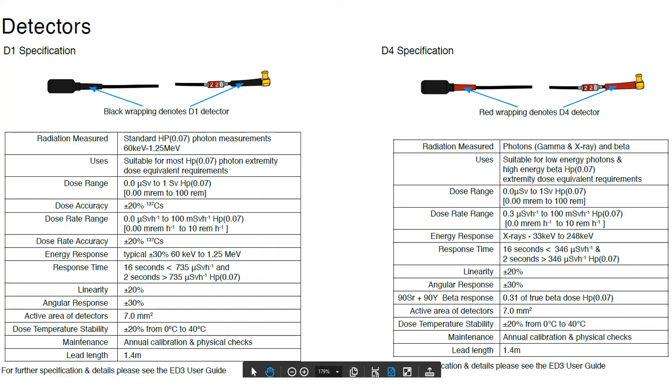This shows the difference between the D1 and D4 detectors. To start with, the D1 detector is wrapped in black at the beginning at the end of the lead, near the detector end and near the connector end, while the D4 detector has red. The D1 detector is able to measure photons starting around 60 keV upward, but is not able to measure betas. It has a much flatter energy response and stays within the IEC guidelines.